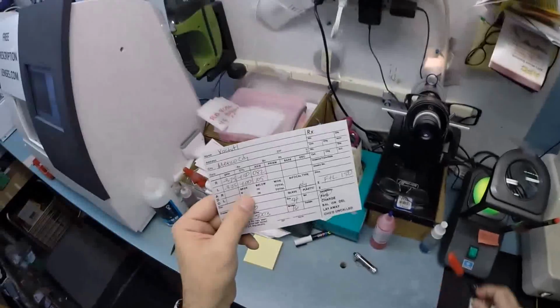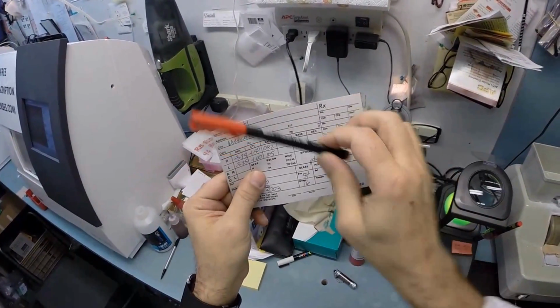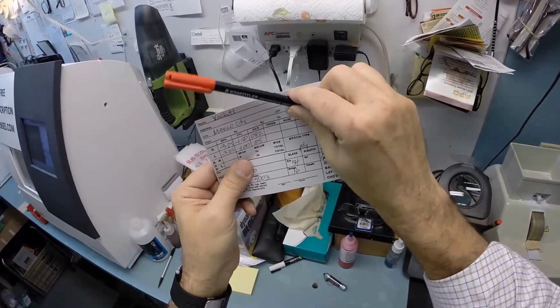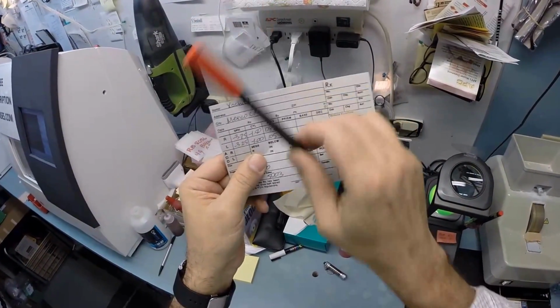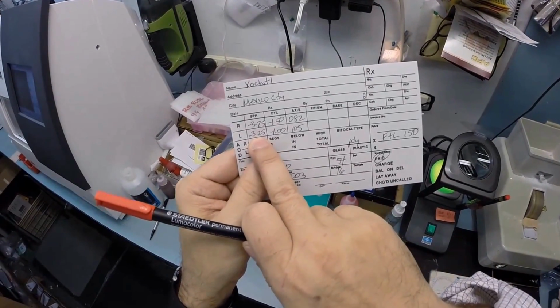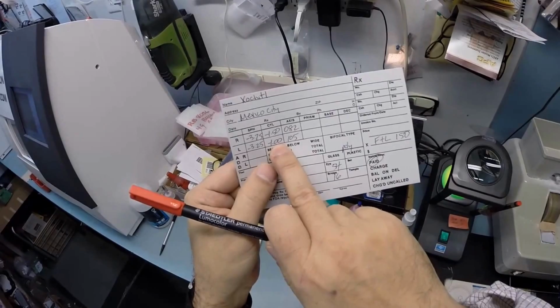Think of it as the fine-tuned knob, and if we were going to turn that knob, a straight line is from 0 to 180 with 90 being in the middle. We're going to turn that fine-tuned knob almost to 90. We're going to turn it to 82. Now for your left eye, you only need 13 steps of correction for your nearsightedness, and you only need 4 steps of correction for your astigmatism.